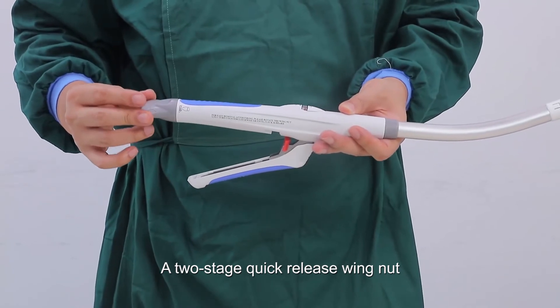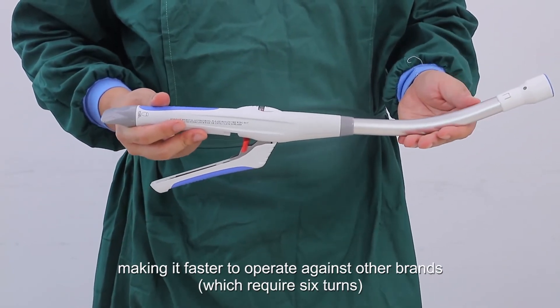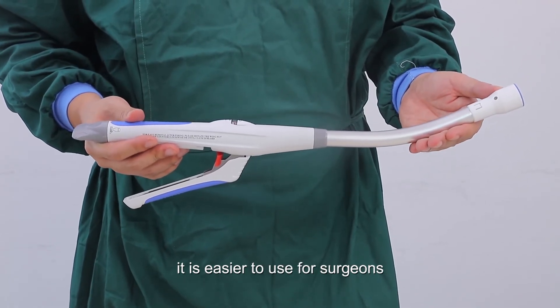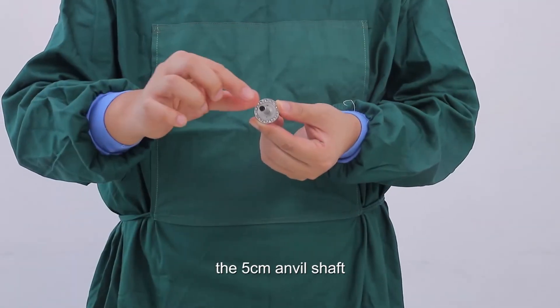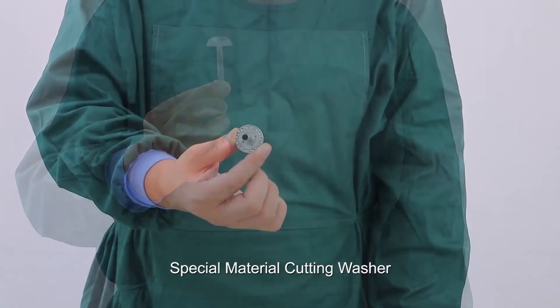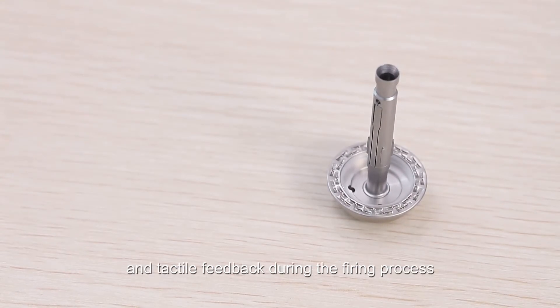A two-stage quick-release wing nut can fully open the stapler in four full turns, making it faster to operate compared to other brands and easier to use for surgeons. The 5cm anvil shaft provides a clearer view of the operative site. A special material cutting washer provides distinct audible and tactile feedback during the firing process.